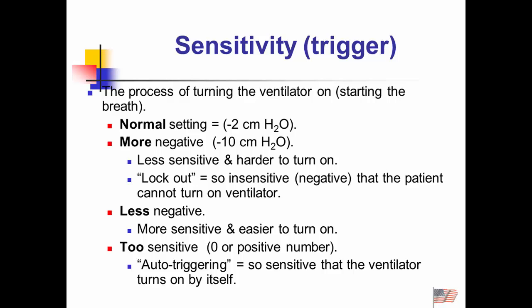Flow, pressure, sensitivity. I used to have a T-shirt that said respiratory therapists do it with pressure and sensitivity. Yeah, it was an old joke.